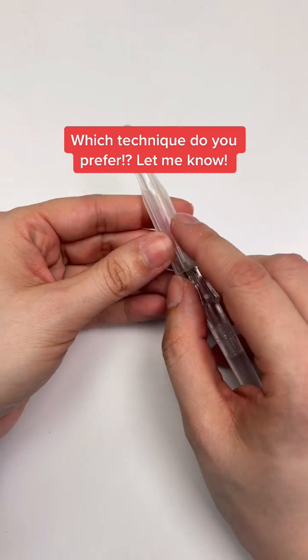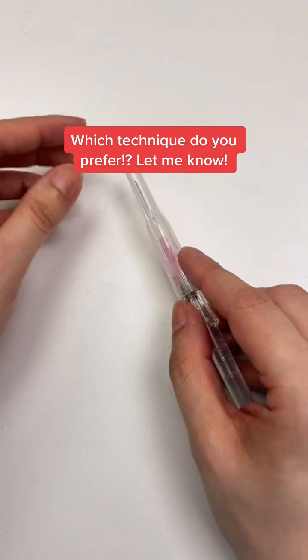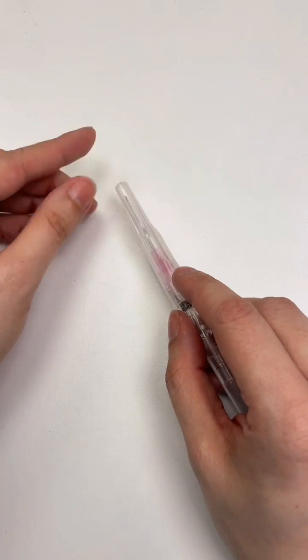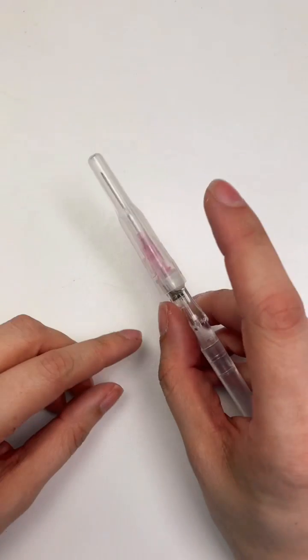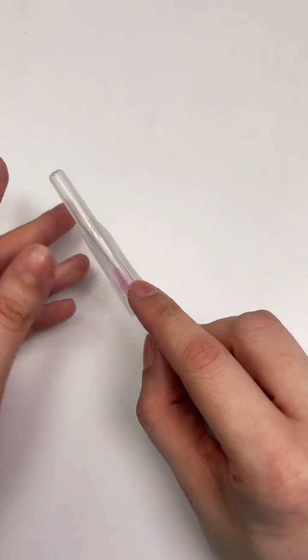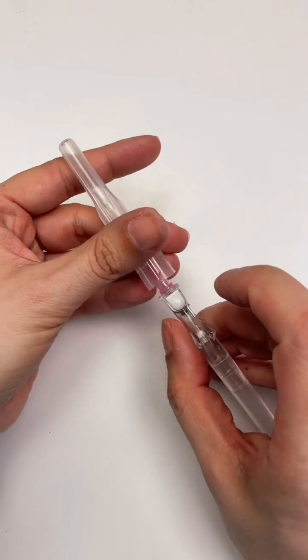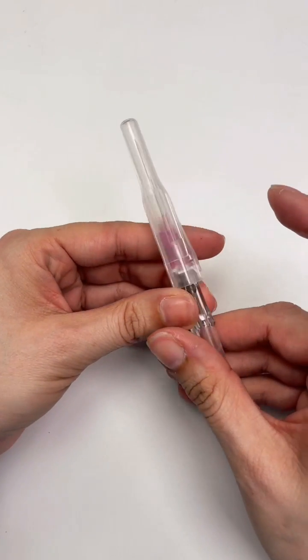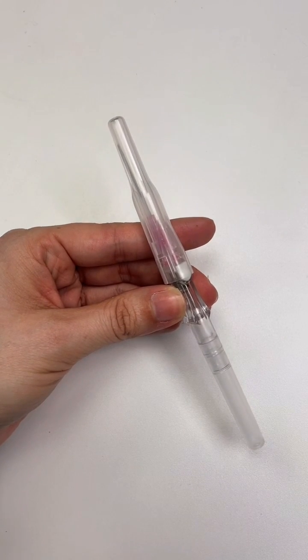Now personally I like the one-handed advancement technique because it allows my other hand to be open to grab supplies and things like that. So if you want to get better at this technique, grab a pen or your IV needle like this and just practice sliding the cap off. It's just that simple. Just practice this motion and that's going to help you improve that manual dexterity and that fine motor motion for the one-handed catheter advancement technique. I hope this helps.